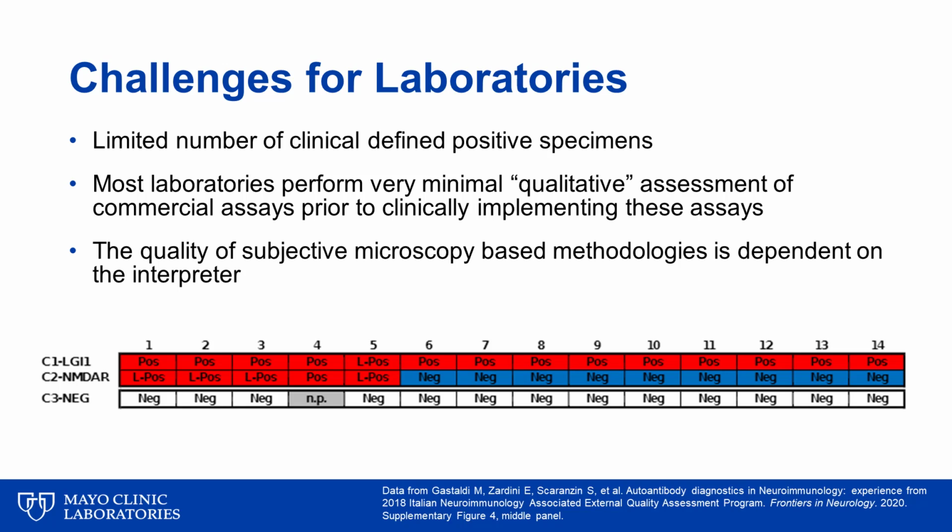While there are other factors at play unrelated to the interpretation, many laboratories do perform minimal validation verification of the performance of commercial kits with a limited number of positive and negative control samples. This likely relates to the lack of availability of positive specimens and urgency to validate these assays quickly, and in some circumstances, an underestimation of the complexity of the interpretation and dependency on the claims by the manufacturer, where highly experienced individuals would have interpreted the assays, but this may not reflect the actual testing laboratory's capabilities.